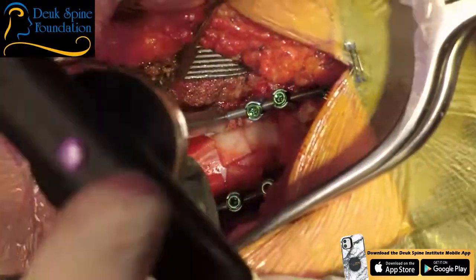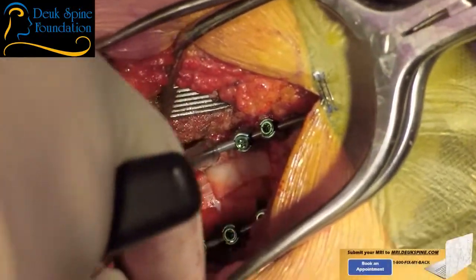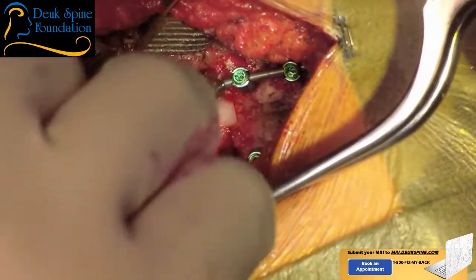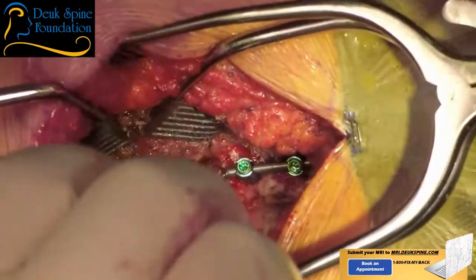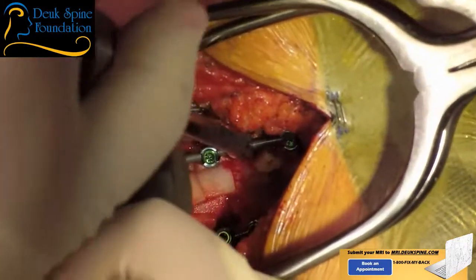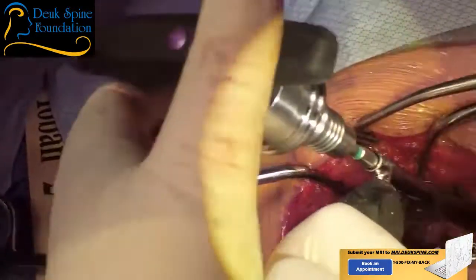I love the design, though. The screw to driver interface is amazing. This star shape is my favorite. It just has so many points of contact, you know? It just really allows you to distribute the load equally onto the set screw head, unlike the hex, which a lot of these systems have.